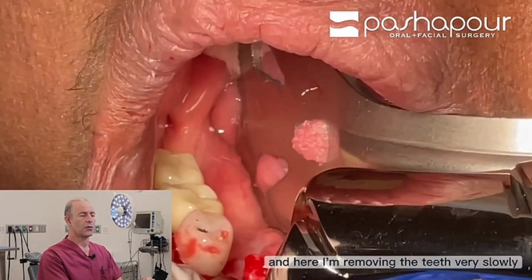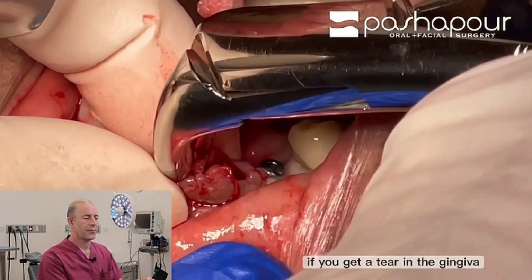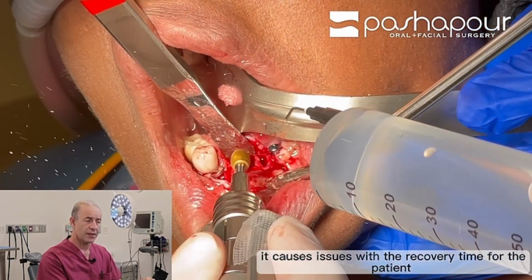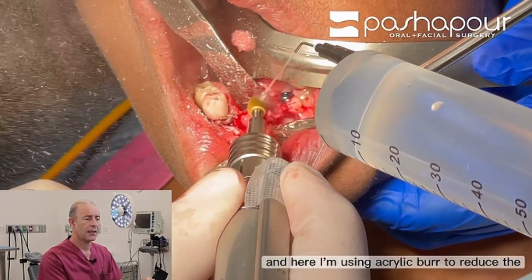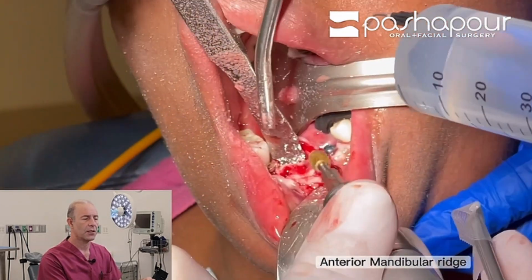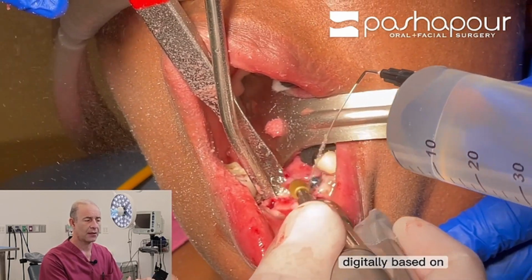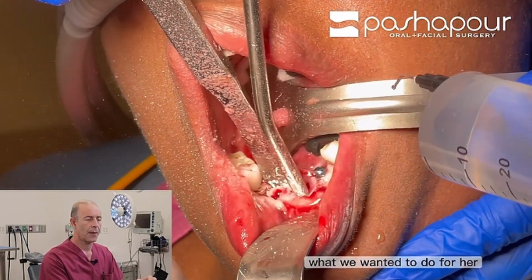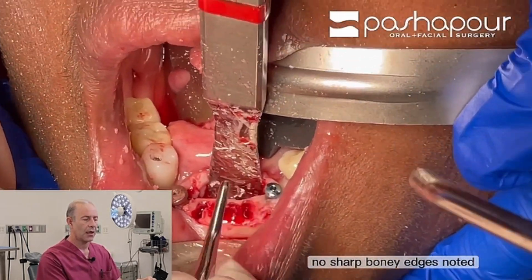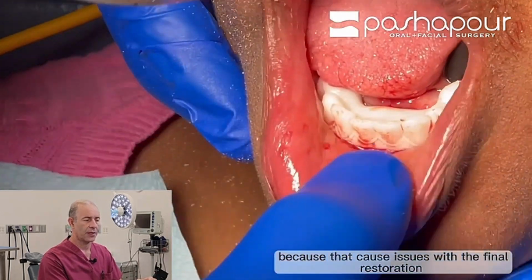And here I'm removing the teeth very slowly because I don't want to get any tear in the gingiva. If you get a tear in the gingiva, it causes issues with the recovery time for the patient. And here I'm using an acrylic burr to reduce the anterior mandibular ridge. This amount of reduction was planned digitally based on what we wanted to do for her. The bone is nicely reduced, no sharp bony edges noted. And you don't want to remove too much, again, because that causes issues with the final restoration.